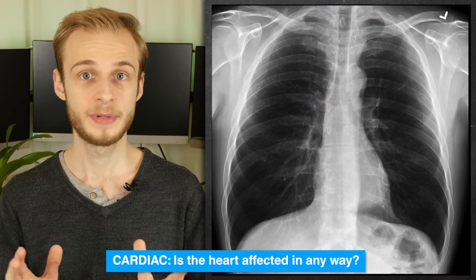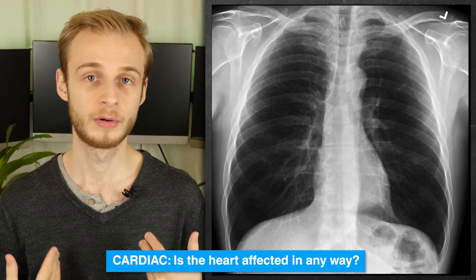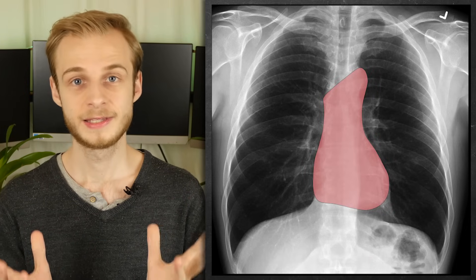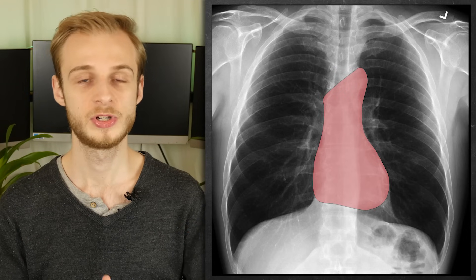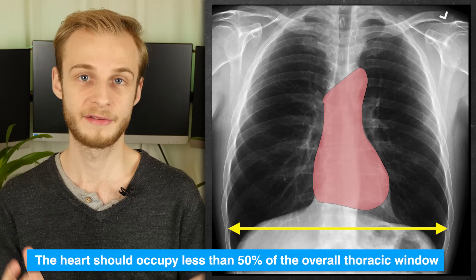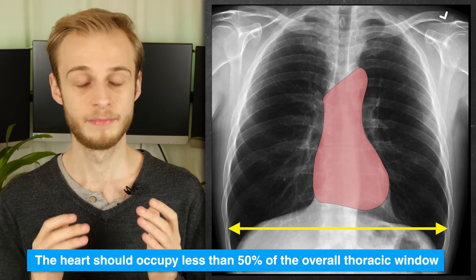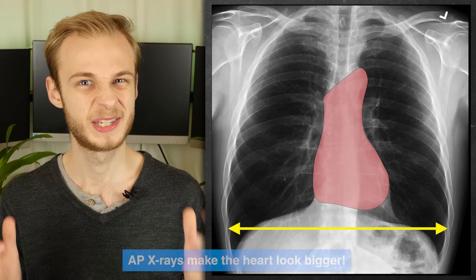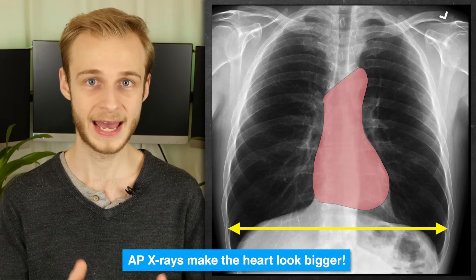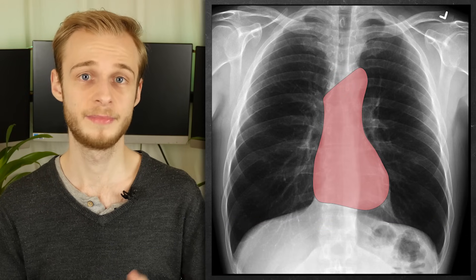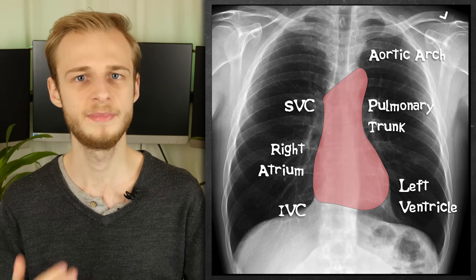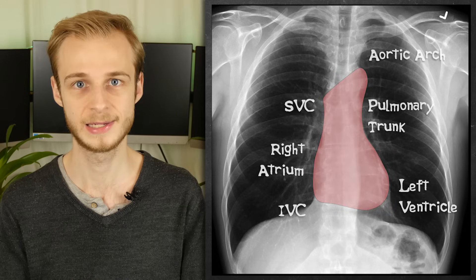C is for cardiac. A lot of people think chest x-rays are only to do with breathing problems, but the heart is one of the most important things to assess. The first and easiest thing to check is its size, which should ideally be less than 50% of the entire thoracic window. If it's more than that, we would clinically have cardiomegaly. It's important to remember that AP x-rays exaggerate the size of the heart, so you can only make cardiomegaly decisions based on a PA x-ray. We also need to check the right atrium and the left ventricle, which make up most of the visible heart border.